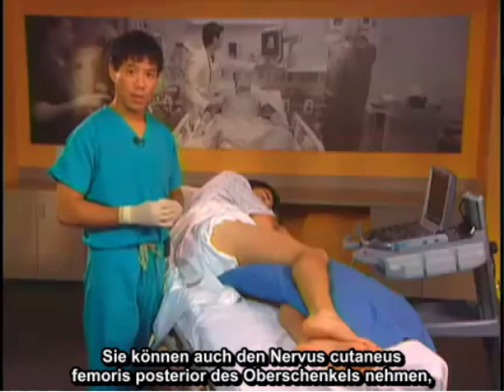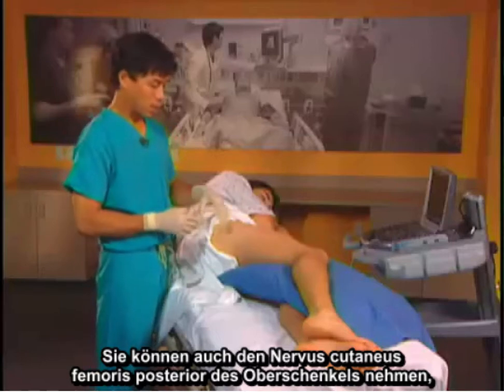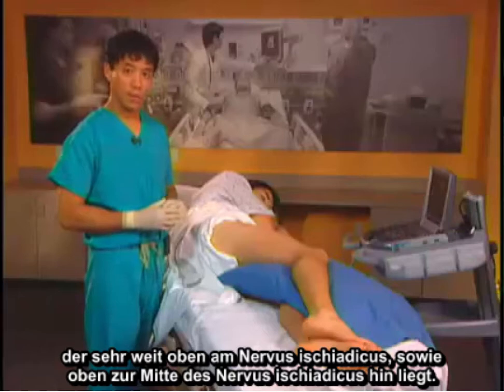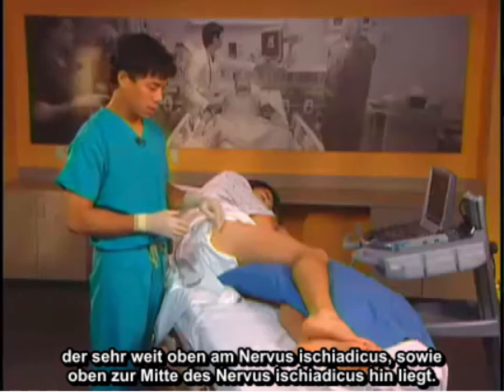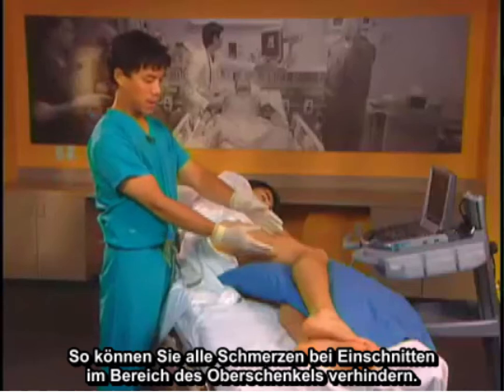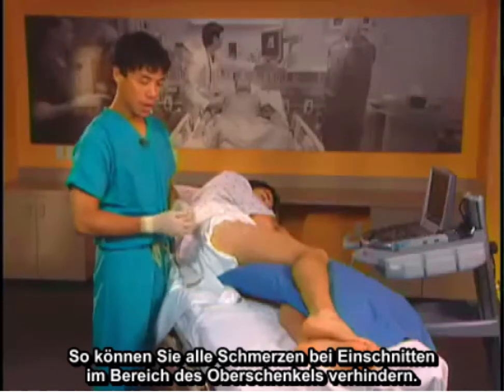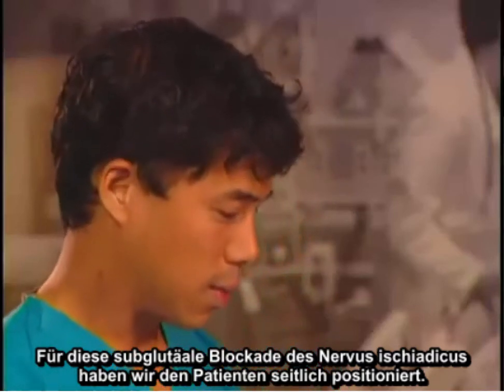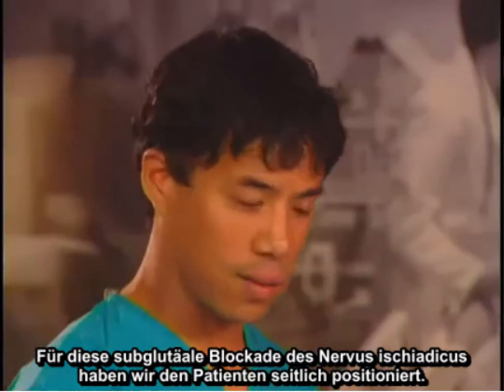You may also get the posterior femoral cutaneous nerve of the thigh, which comes off very high on the sciatic nerve and is also medial to the sciatic nerve as well, high up. This way you can cover any kind of pain of incision in the upper thigh area. To position patients for the subgluteal sciatic nerve block, we position the patient lateral.